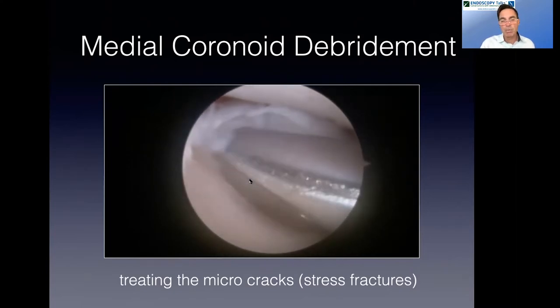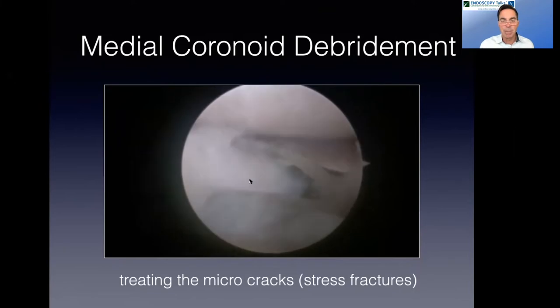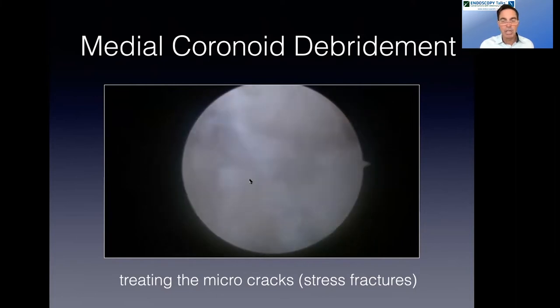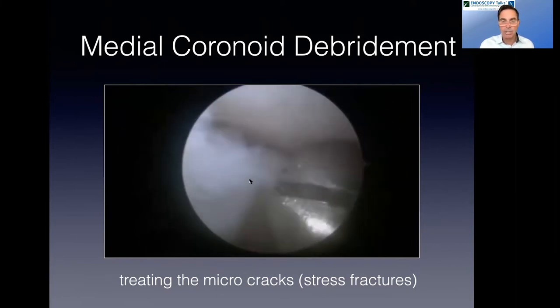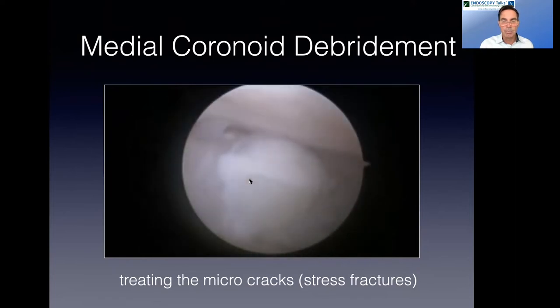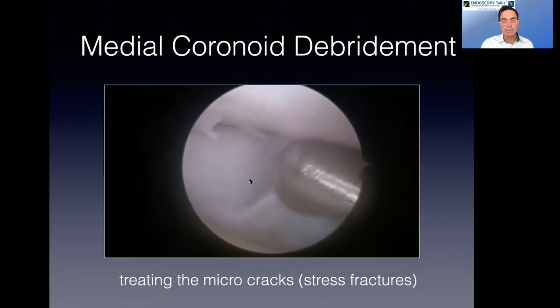So this is why I really like an arthroscopic shaver. You can do so much with it. And again, we all try to avoid spending money that we don't have to. But in my opinion, this thing will last 20 years. And so, get one of these. It'll make your life easier and you will be a better arthroscopist. So this allows us to go in very easily, remove these fragments, and pull them out of the joint very atraumatically.